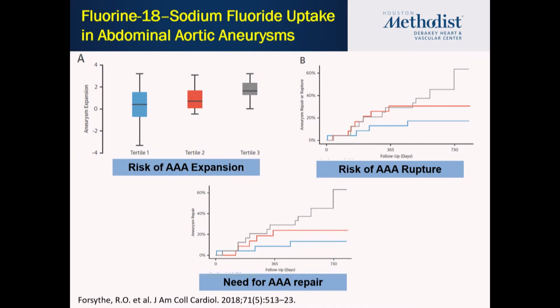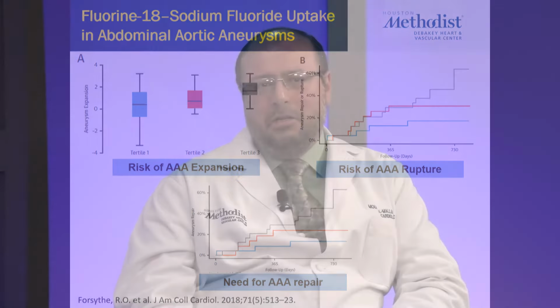I mean, it is easily handled. How difficult is it to make these tracers? Don't they have to use a cyclotron? Nowadays this one has a half-life of 2 hours, so if there is a cyclotron in the city you live in, it doesn't need to be far away. It doesn't need to be right next to the machine, because these F18-based agents have a half-life of 2 hours, so technically you are able to get the dose you need. Now there are companies where you tell them, I need 10 millicuries of sodium fluoride at 11 a.m., and they will bring it to your hospital on time.